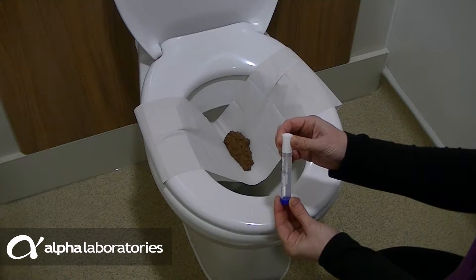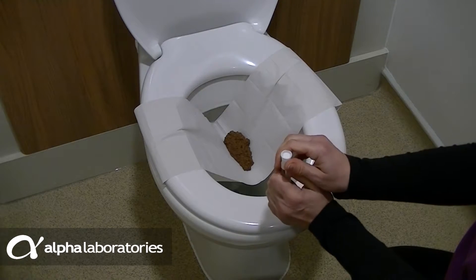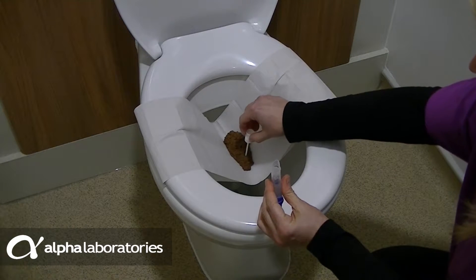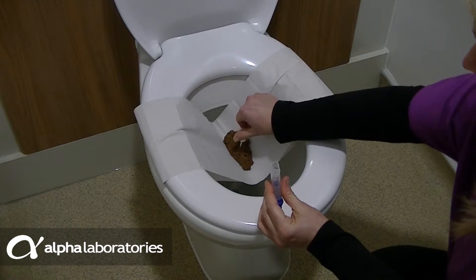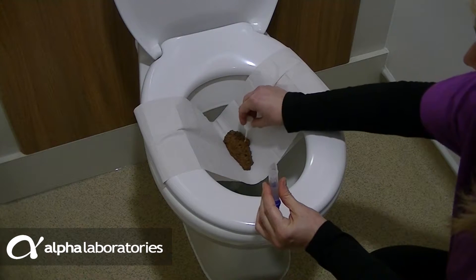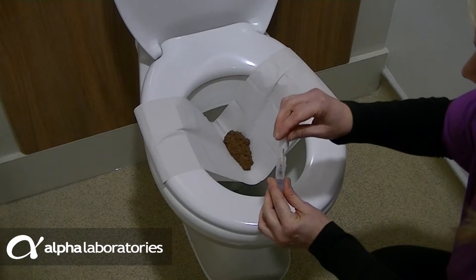Hold the Calix device with the white cap pointing upwards to avoid spills. Remove the sampling pin by turning the white cap clockwise and pulling up. The white cap is designed to open and lock only once, so do not test before use. Dip the sampling pin into the faeces and twist before removing. Repeat this process in three to five different places in the sample to ensure the grooves are completely filled.